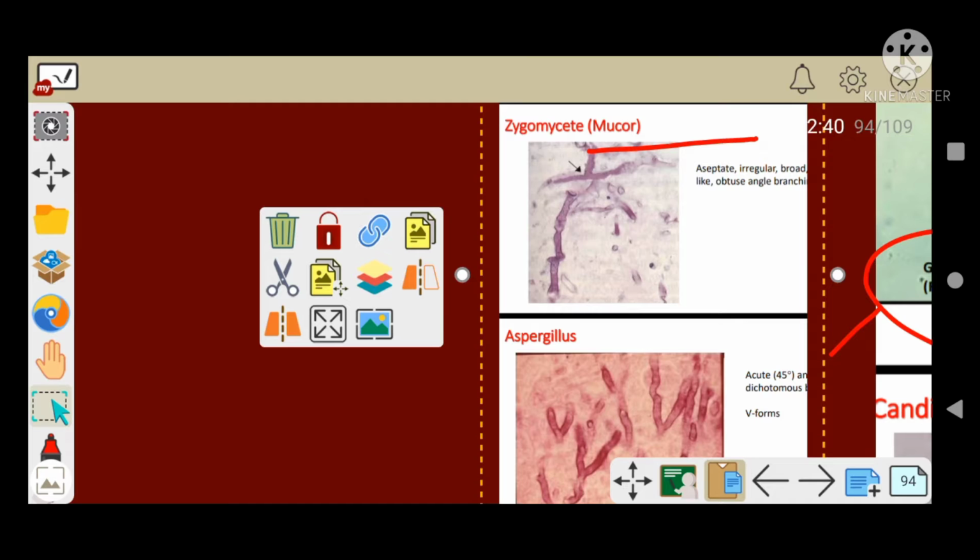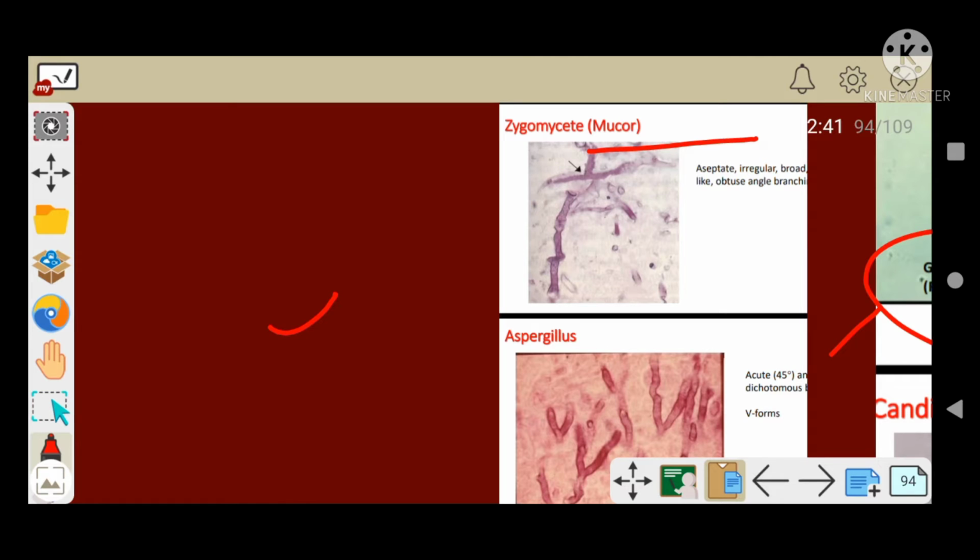This is important, particularly in this COVID setup, because post-treatment patients of COVID develop mucor. Those who have diabetes or those who have neutropenia, immunosuppression, they all have chances to develop mucor, and treatment is IV liposomal amphotericin B, right? Okay, chalo. This one is your aspergillus.